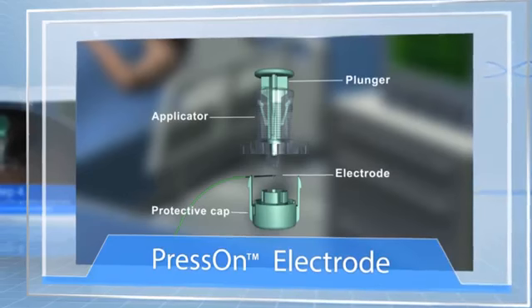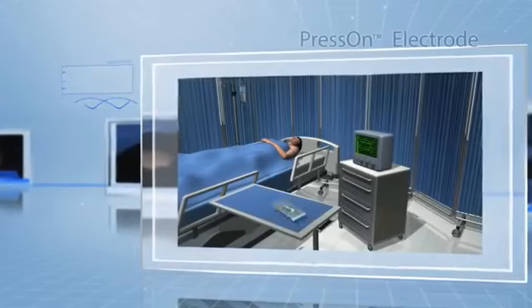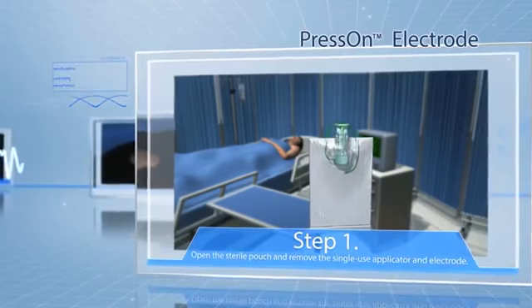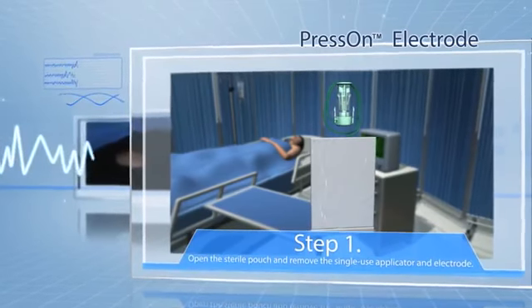Now enjoy a quick guide to using the press-on. Step 1: Open the sterile pouch and remove the single-use applicator and electrode.